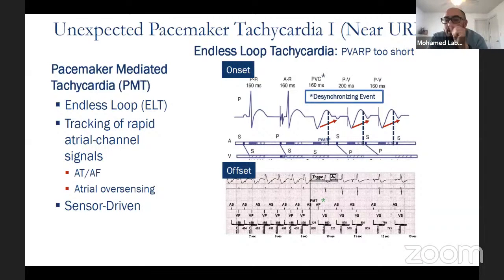Yeah, no, I agree. This is my whole point: it comes down to the clinical scenario. If you think this is viable myocardium and you perfuse it, and you have an indication for a pacemaker, why commit to an ICD before you put in a pacemaker and give it some time to recover? That's my whole point, and this is what you just stated in your guidelines. But if you think it's not viable, it's dead meat, and regardless of reperfusion, there's an indication for a pacemaker, it's reasonable to just go ahead with an ICD.